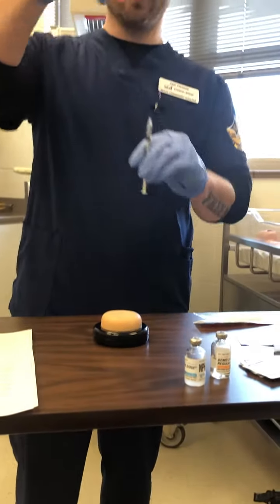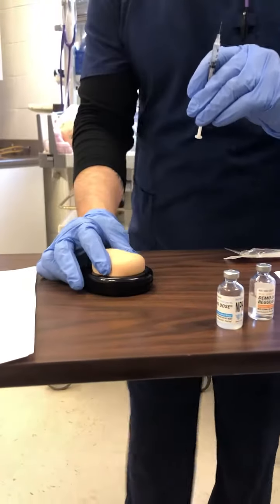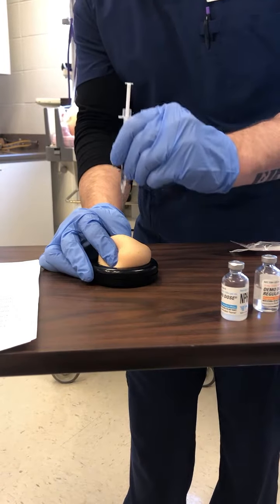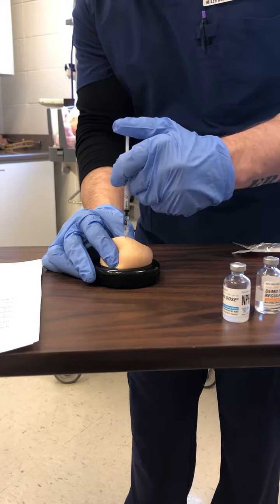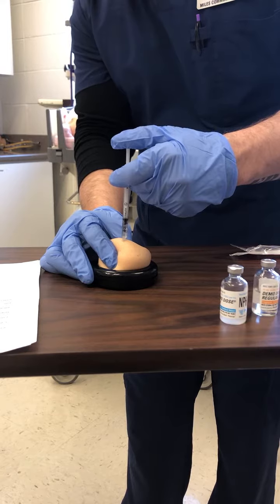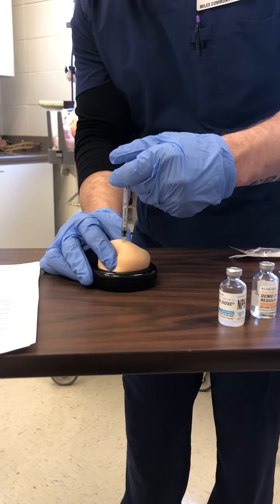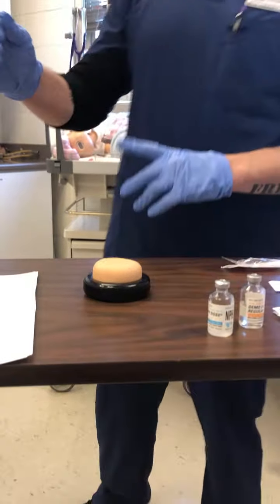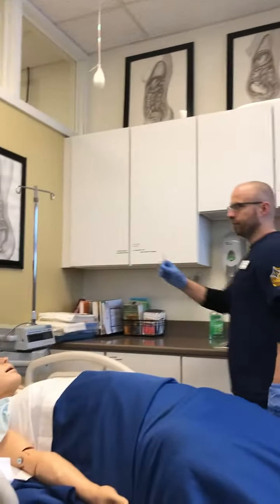I'm going to uncap the needle. I'm going to pinch the skin of the stomach. I'm going to hold it like a dart and inject the needle. I am then going to slowly inject the insulin because there is nothing in my path. I am not going to recap the needle. I'm going to bring it straight to the sharps container.